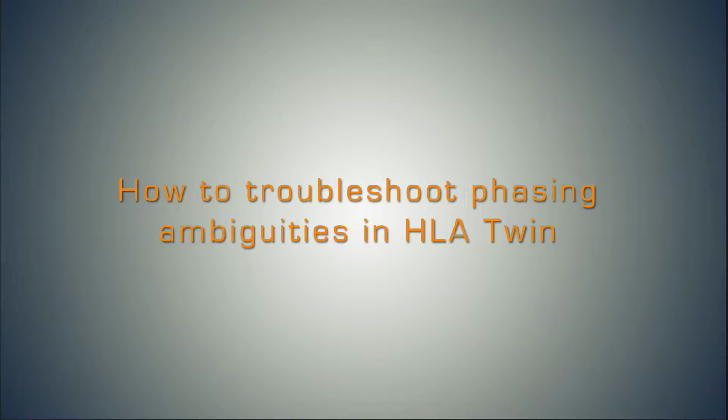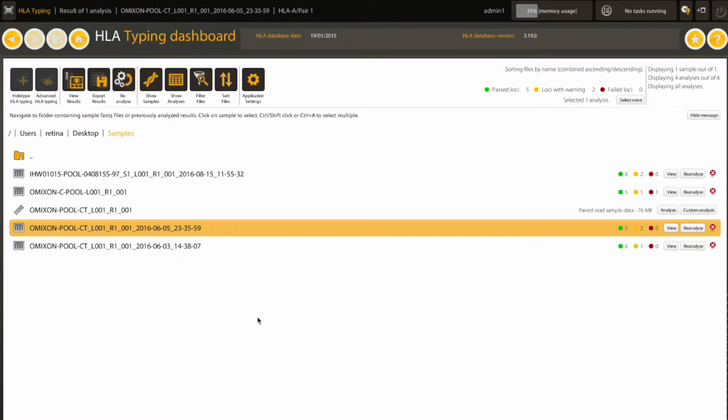In this short video, I'm going to walk you through how to troubleshoot phasing ambiguities in HLA Twin Genotyping software. During analysis, the consensus genotyping algorithm of HLA Twin builds two consensus sequences, one for each allele for every locus of every sample. The variation between the two alleles allows the algorithm to distinguish one allele from the other.